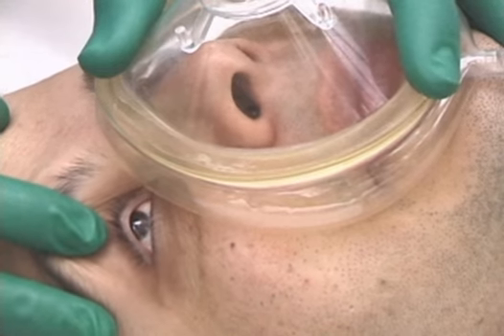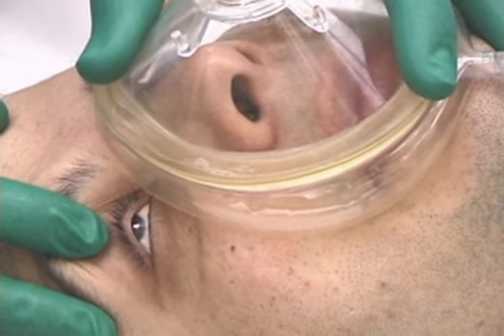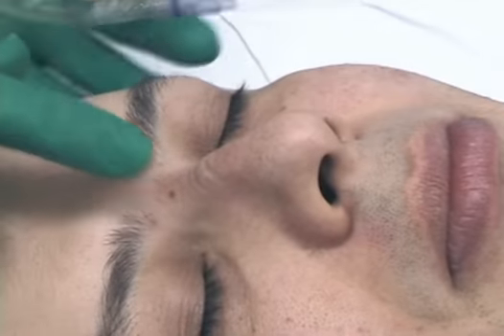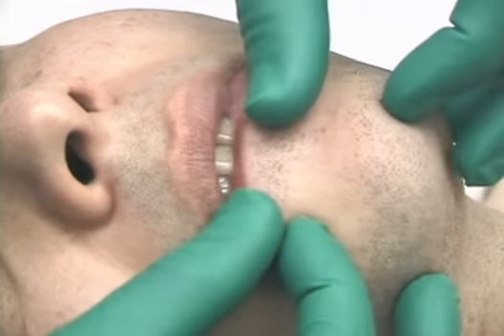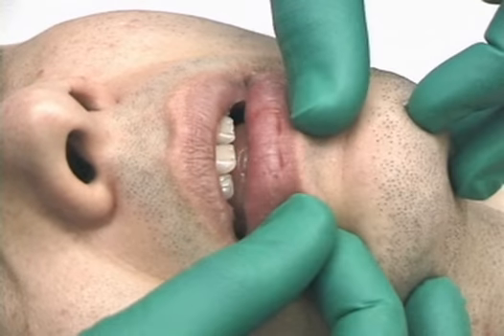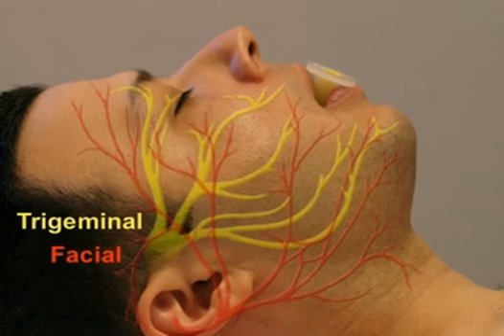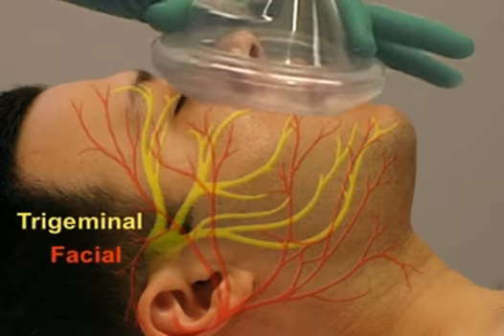Complications other than the inability to ventilate can occur, including corneal abrasions and blindness in the presence of a severe eye injury. Soft tissue injuries, particularly to the bridge of the nose and lips, may result when excessive pressure is applied. Complications such as trigeminal and facial nerve compression have been reported due to continuous, prolonged pressure on the facial structures.